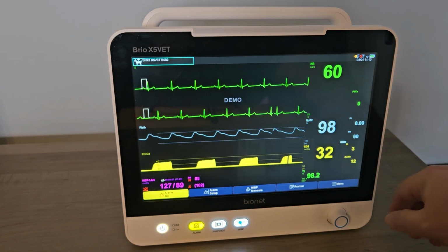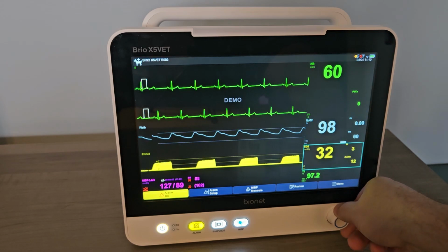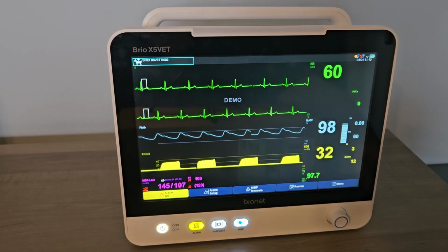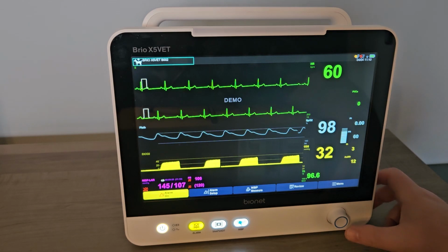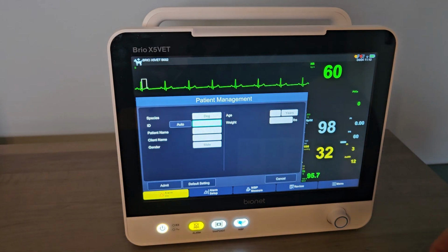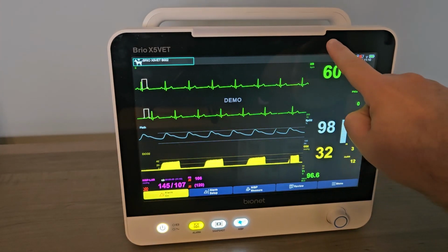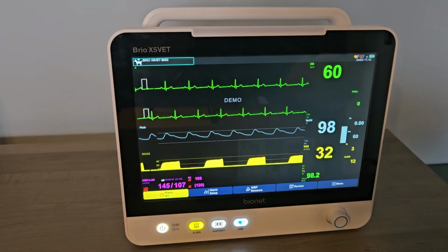If you do not wish to use the touchscreen, you can turn the rotary knob left or right to highlight a majority of options on the screen. Press in on the rotary knob to select the highlighted item. Your alarm light will be displayed in the upper translucent section of the screen once an alarm is triggered.